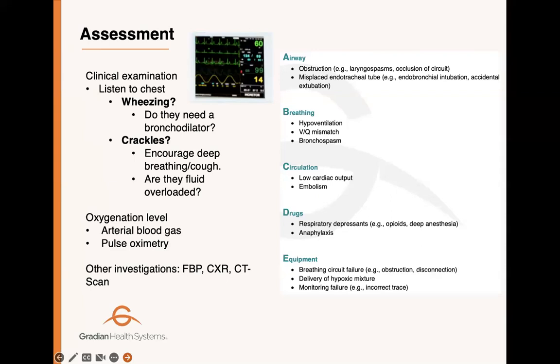And look at the equipment, the breathing circuit, the delivery of your gases. If you are giving nitrous oxide, there is a concept of hypoxic mixture, or if you are giving gases in the theater, there is a possibility of giving more inhalational gases than oxygen.